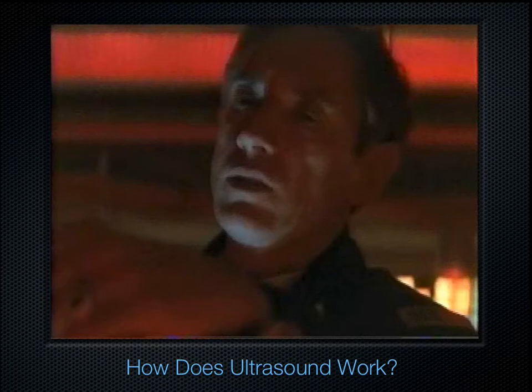We know how fast sound travels in soft tissue, and the ultrasound machine releases the pulse. It goes into the body's tissue and then returns, and depending on how long it took the sound to come back, it plots a dot on the screen in terms of depth. So the longer it takes the sound to come back, the further down the screen the ultrasound machine will plot that dot.